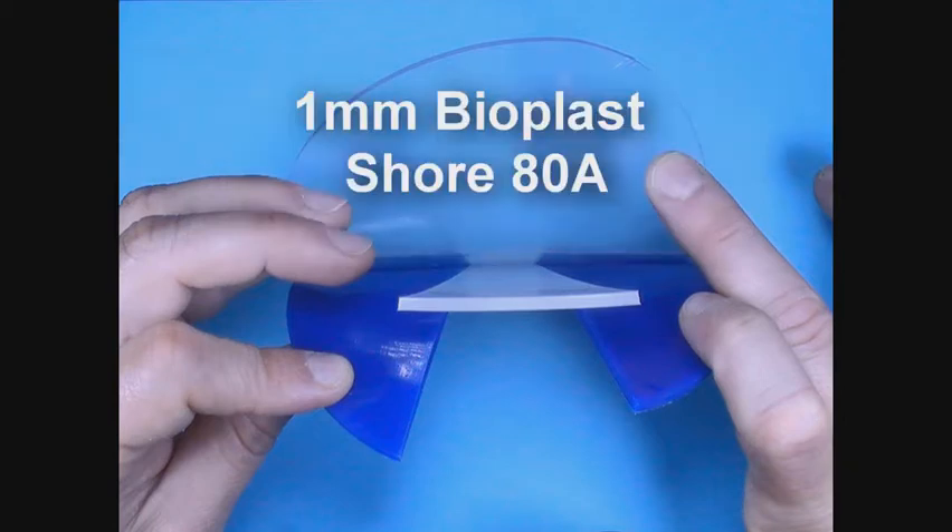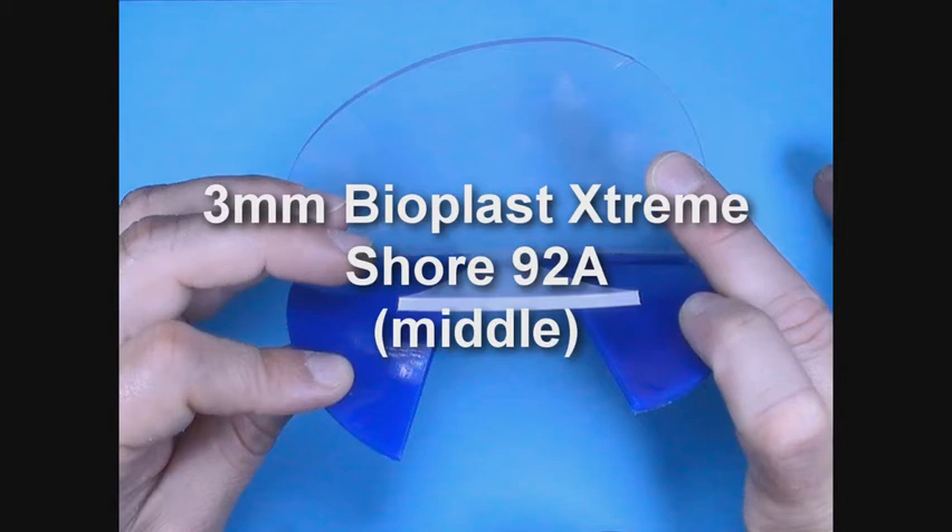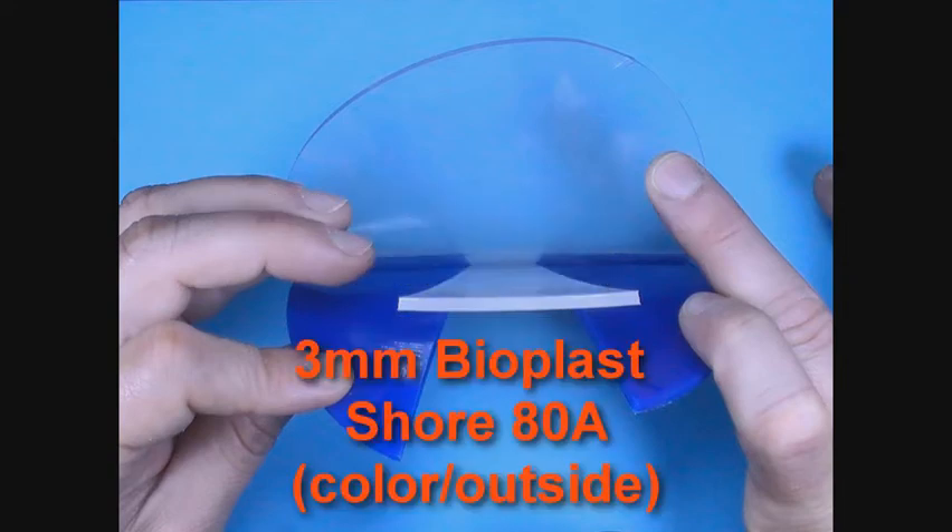The 4mm thick BioPlastic Stream Pro plate consists of a clear 1mm BioPlast laminate cover plate with Shore 80A hardness, a V-shaped clear 3mm Xtreme frontal reinforcement section and middle of plate consisting of Shore 92A hardness, surrounded by blue, red, or black 3mm BioPlast Shore A outer sections.